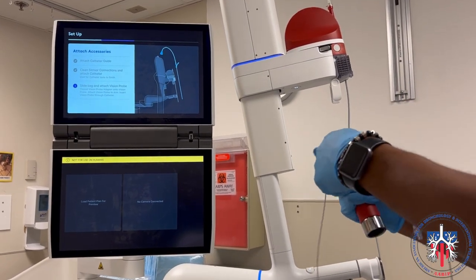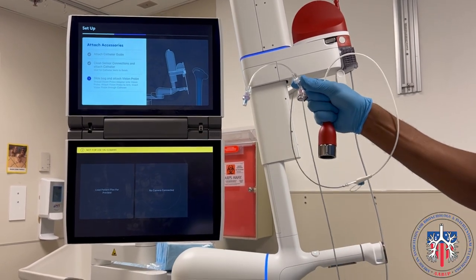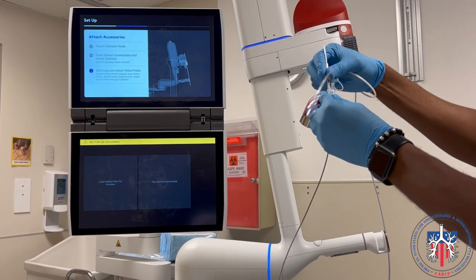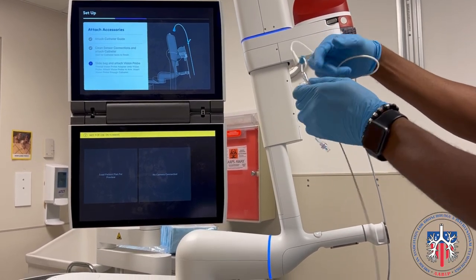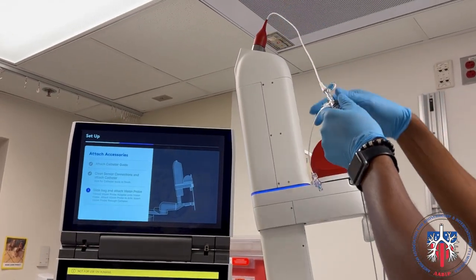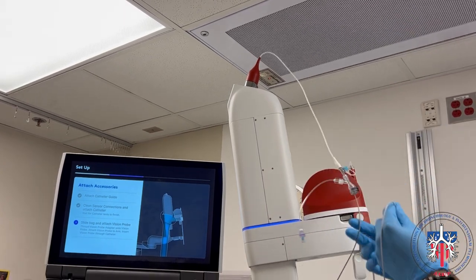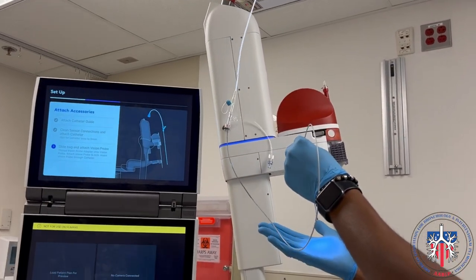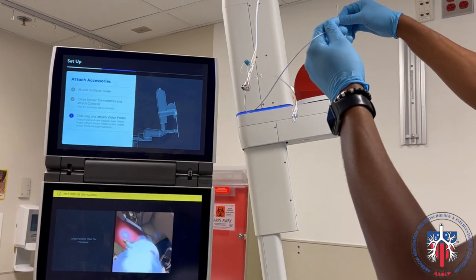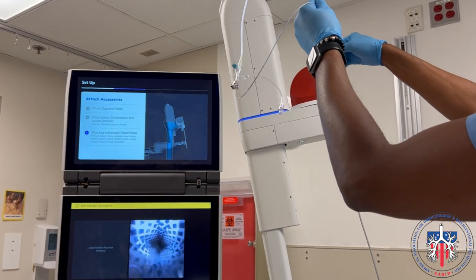Next, thread the vision probe adapter onto the probe and secure it in place before attaching the probe on the robotic arm. Test to ensure the vision probe is detected by the monitor as secured. Next, insert the vision probe into the catheter.